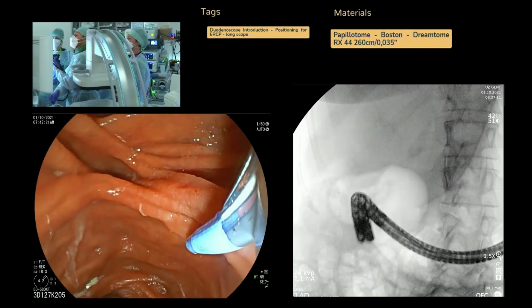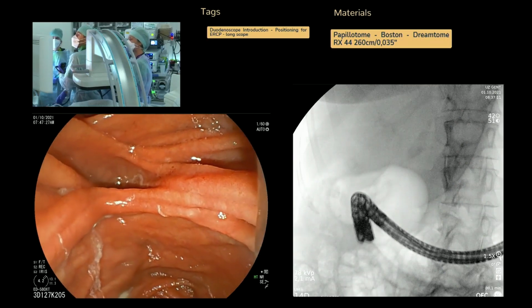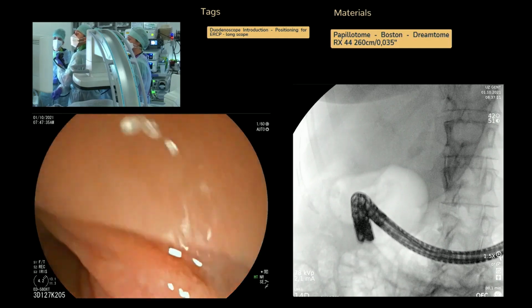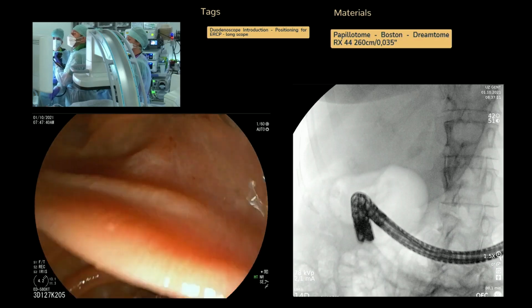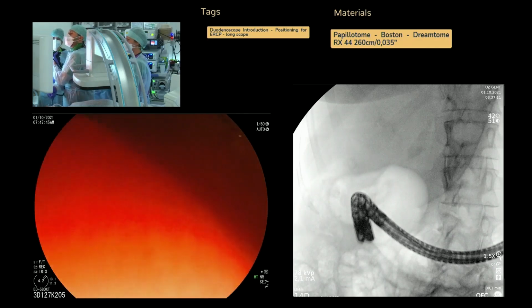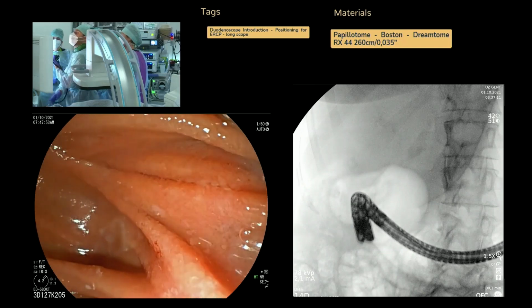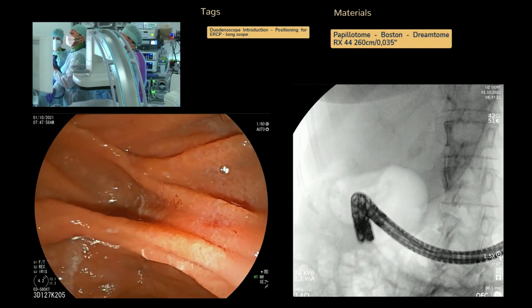We indeed make contact with the sphincterotome. We touch the papilla, but it's of course extremely important to be very gentle, especially for a trainee. I think it's very important to know that you have to be very gentle with the papilla, bring it in the desired position first, and then touch it gently. And we go for guide wire guided cannulation. So in general, we don't inject contrast. It's also recommended to not inject contrast.